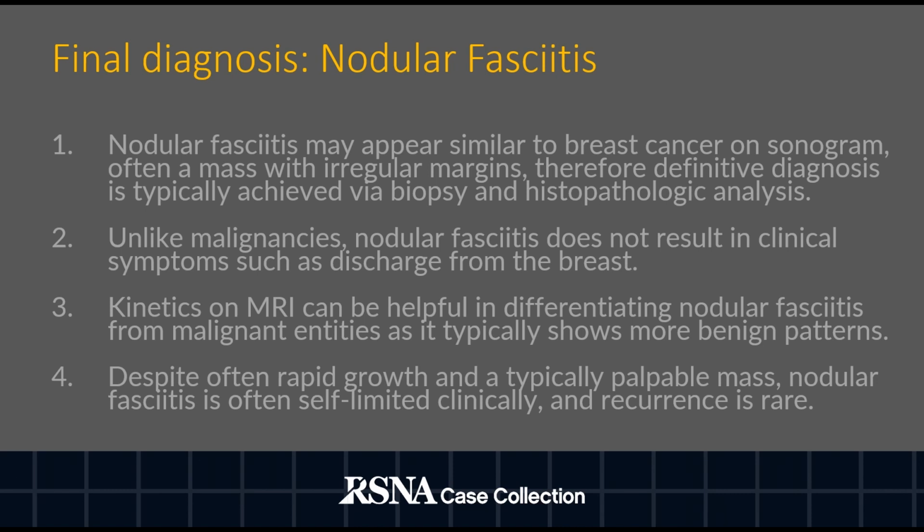Nodular fasciitis typically shows benign patterns of kinetics on MRI, unlike malignant entities. Despite often rapid growth and a typically palpable mass, nodular fasciitis is often self-limited clinically and recurrence is rare.